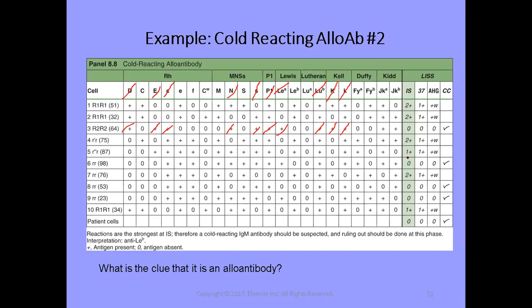We're going to go to this cell next, which is negative at all reaction phases. We're only going to look at what's left. Little e, F.